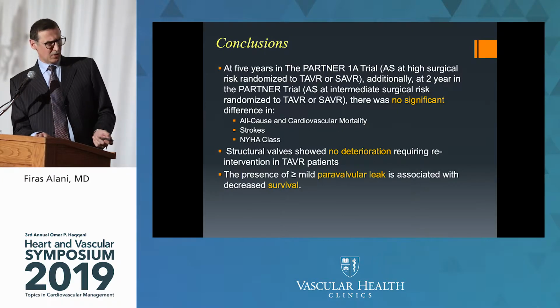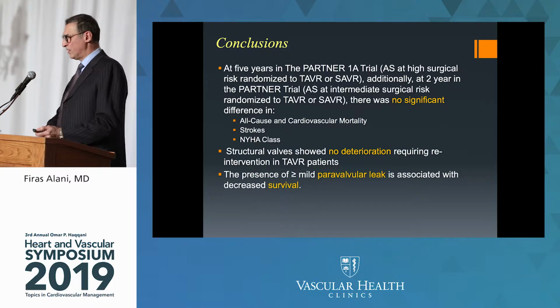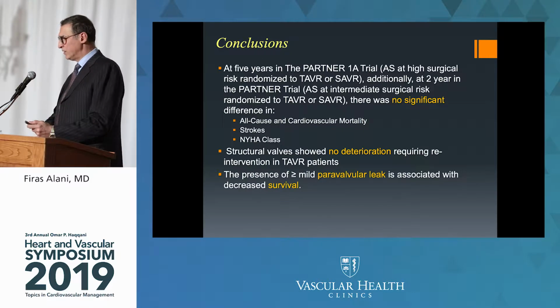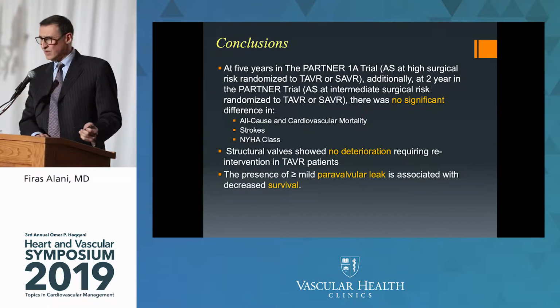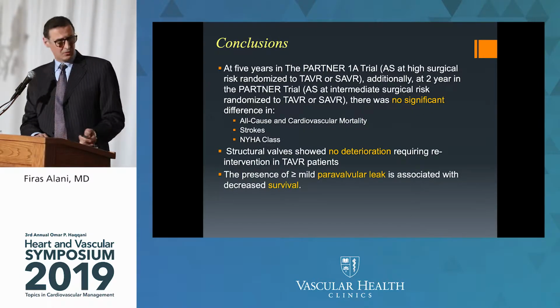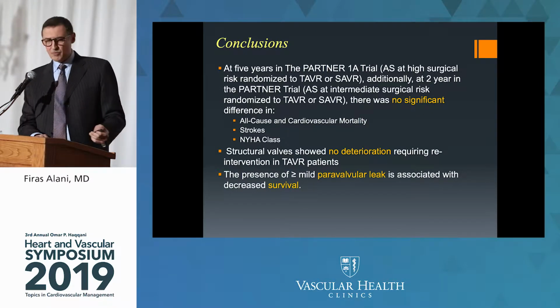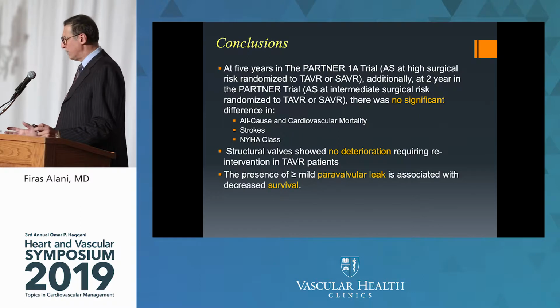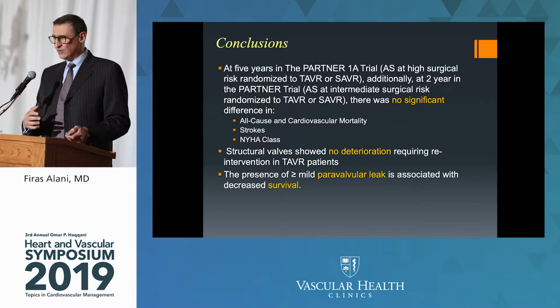And more recently with the low risk, we see the repetitive theme of no significant difference between TAVR and SAVR. That is in all-cause mortality, in stroke, and even in their symptomatology by New York Heart Association class. Again, we also see a repetitive theme of no deterioration in the valve technologies. These valves perform as well as surgical valves out to 5 years.